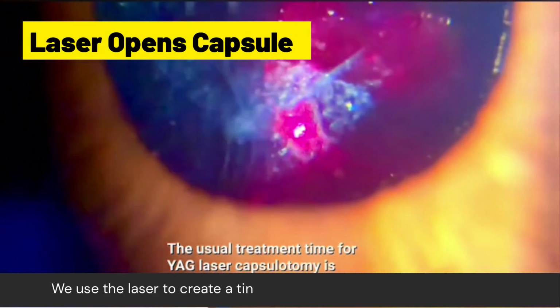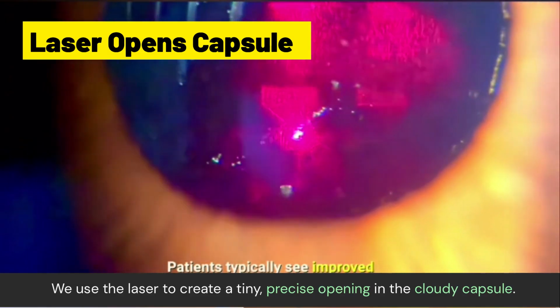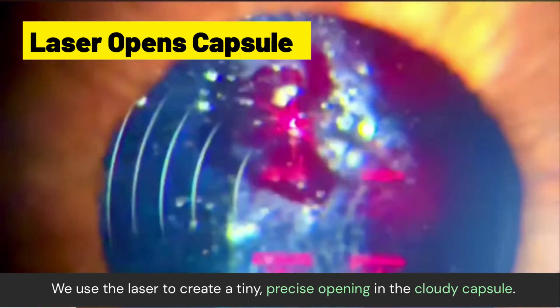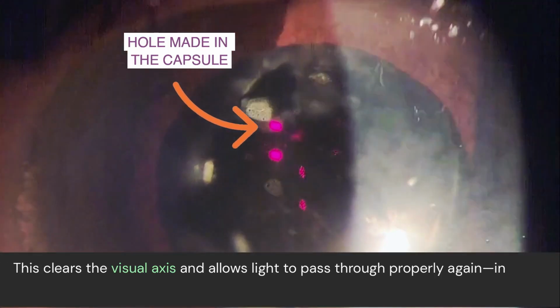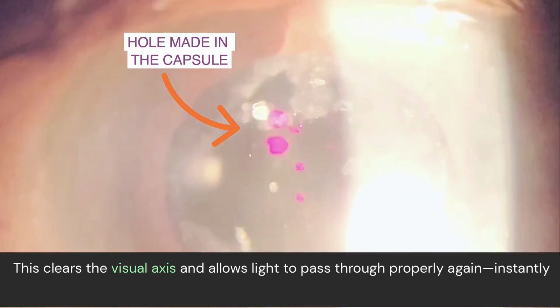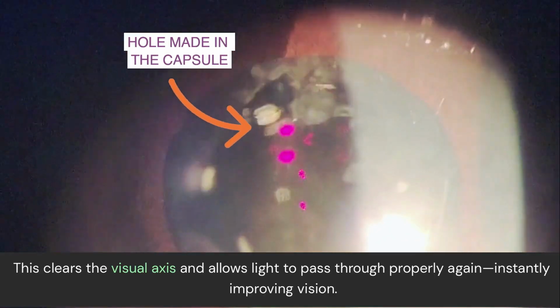Showing laser firing to create tiny, precise openings in the cloudy capsule. I hope you see that. It's amazing, right, how the laser clears up the lens? It allows light to pass through properly again. So this one instantly improves the vision of the patient.